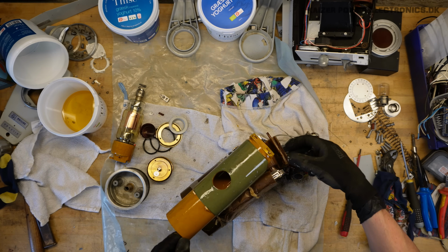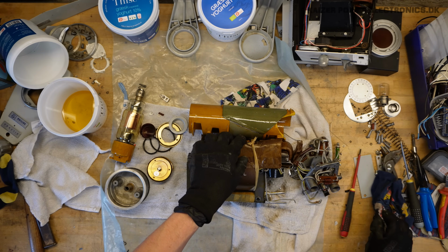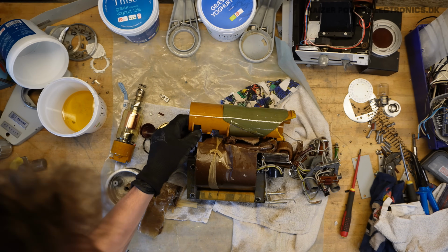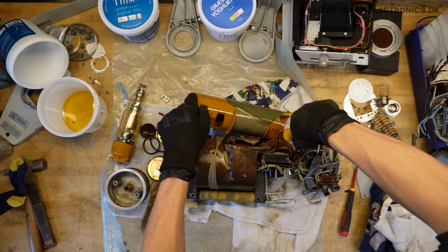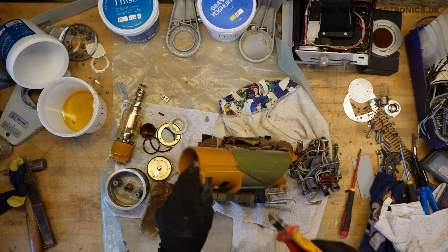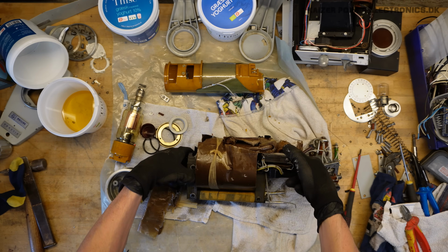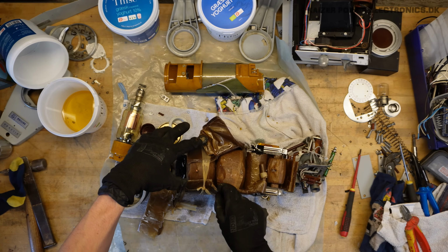And here we have our assembly. It would have been nice to actually prepare to use some tools. Up here we have the high voltage connection from the high voltage transformer to the tube socket, and over here we have the cathode connections. We also have some grounded shielding around it. Now the filament or cathode transformer, we don't need that anymore. I'm actually just interested in this high voltage transformer here.